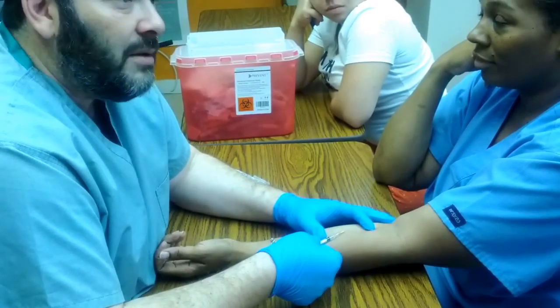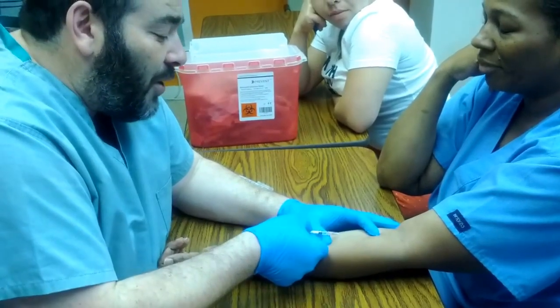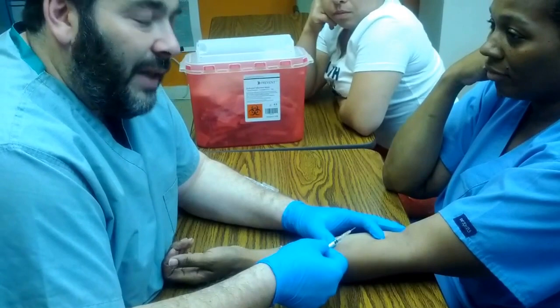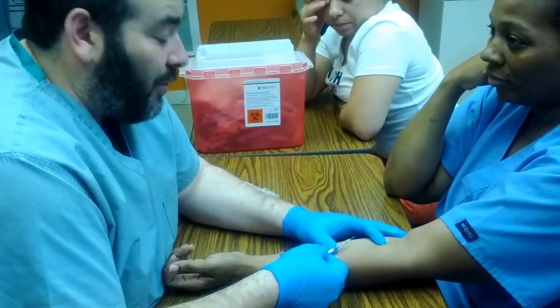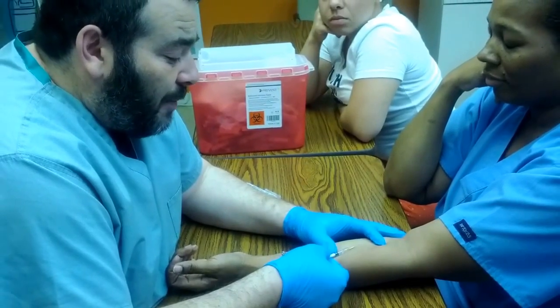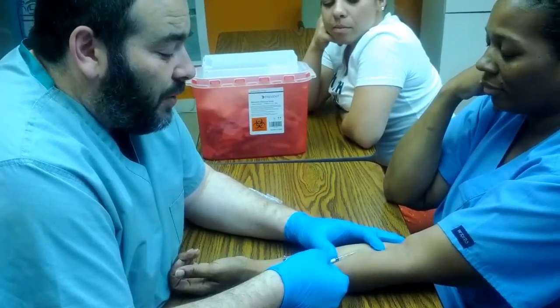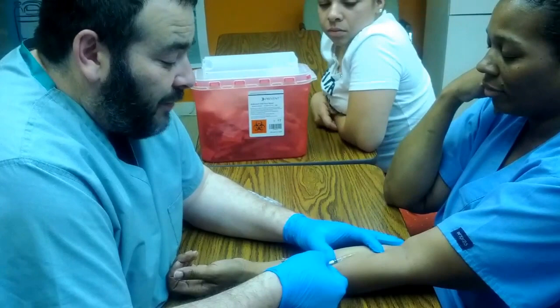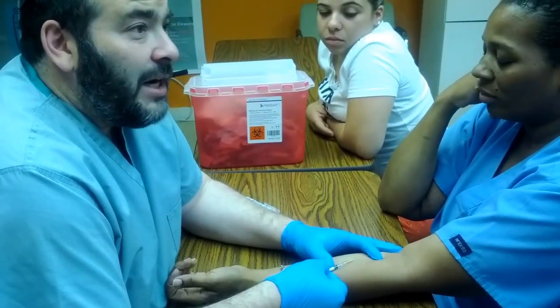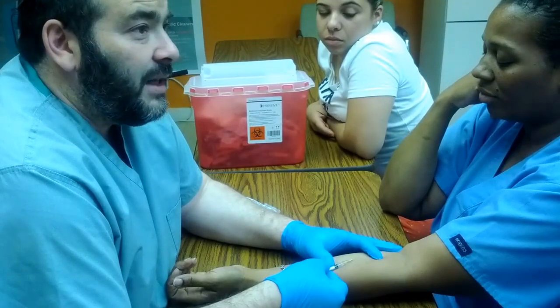See how flat this is? I'm not going at an angle, I'm not going over my thumb, I'm not doing any such thing. I want to be flat because we're doing an intradermal or into the skin. Place it down just like so, and then press it like so, pushing the skin downwards. And all you have to do now is move the syringe forward and stop moving it forward as soon as the shiny part of the bevel has disappeared under the skin.